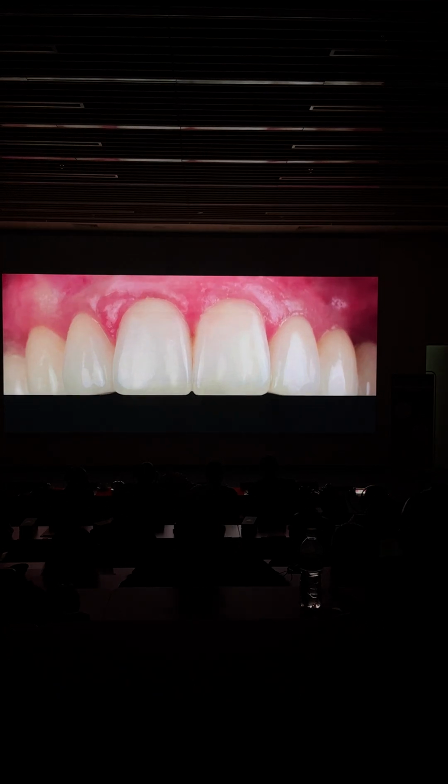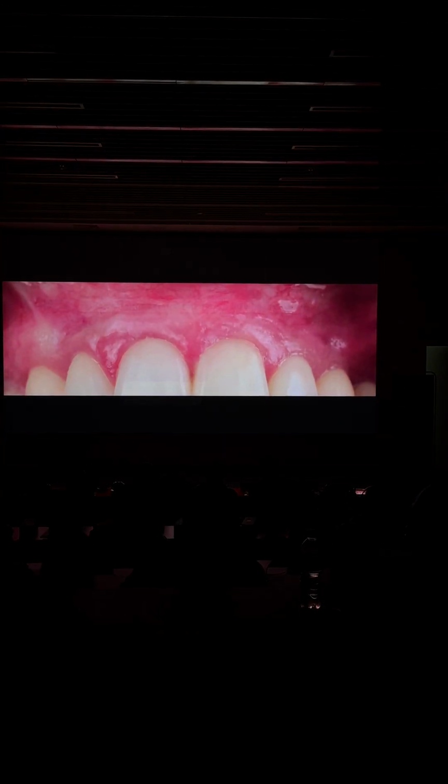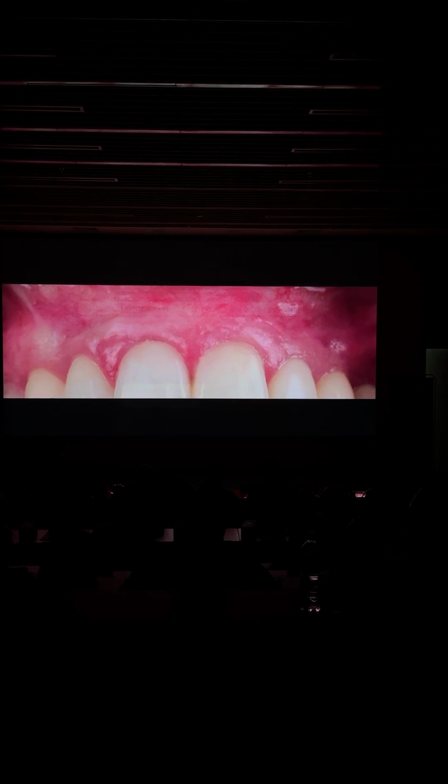Of course, we have been blasting all the scars she had from the maxillofacial surgery. And you can see how the tissue is becoming little by little keratinized and having a nice look of it.